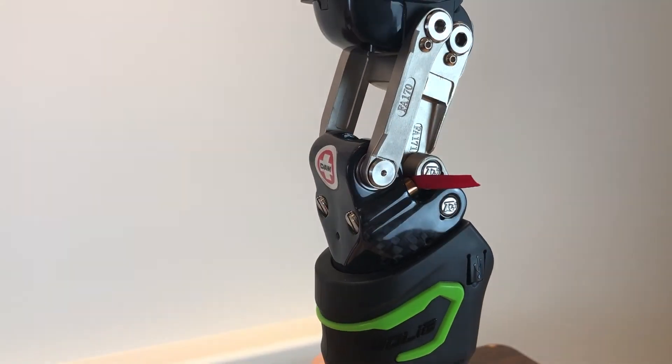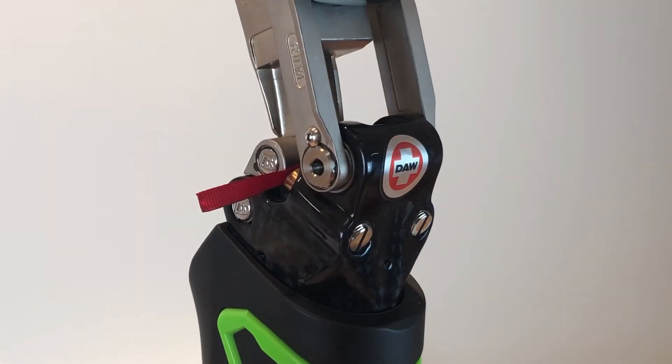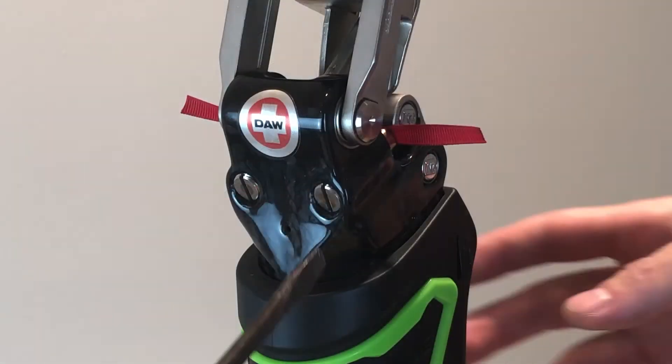The purpose of the red tabs is to ensure there is sufficient pressure on the middle posterior axis for the stance flexion feature to function properly.